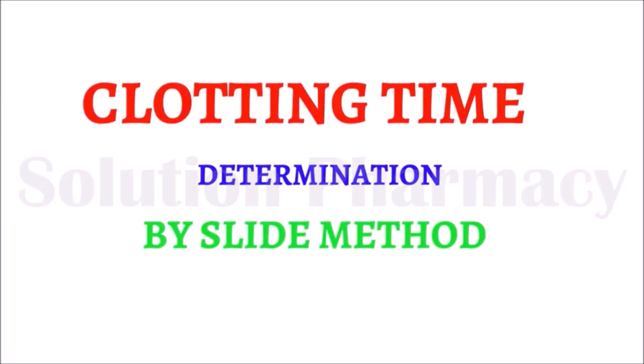Today in this video we will tell you how to determine the blood clotting time by capillary method and by slide method. So let's start.